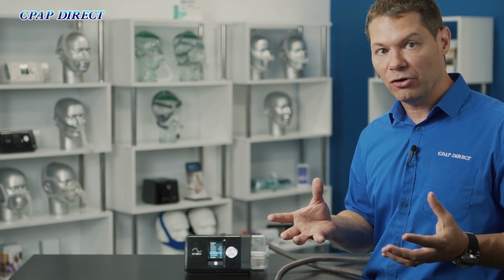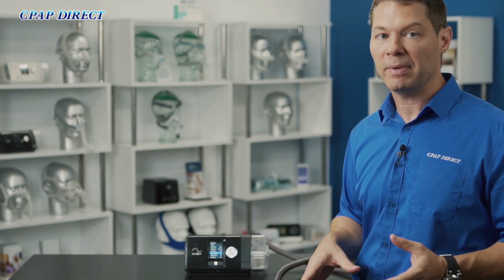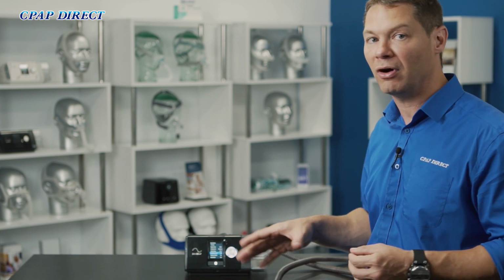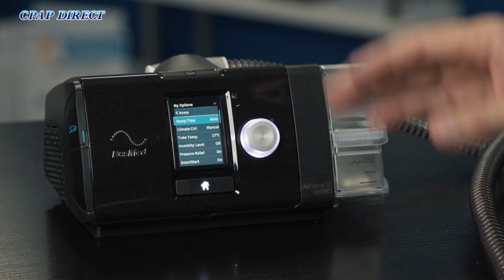The reason why we want to keep the humidifier turned off when we're going camping is because the humidifier is the one part of the component that draws the most amount of power. So if you're working on battery power, you don't want to flatten the battery during the night. So turning the humidifier off just means that you'll be able to go all night with therapy and not wake up gasping for air.